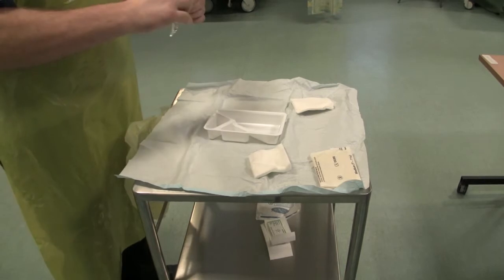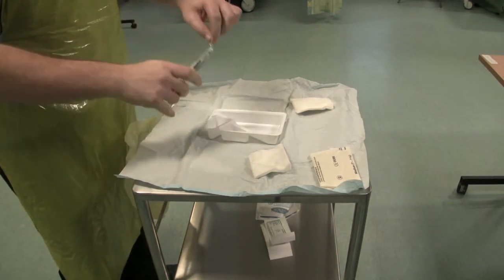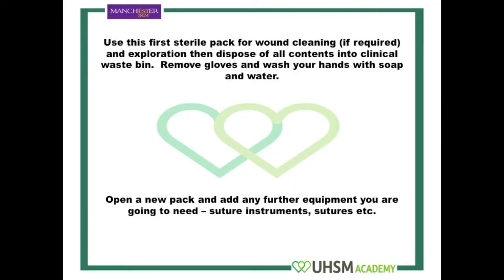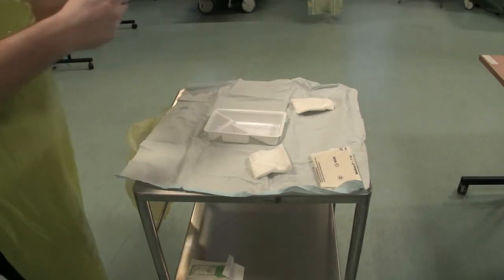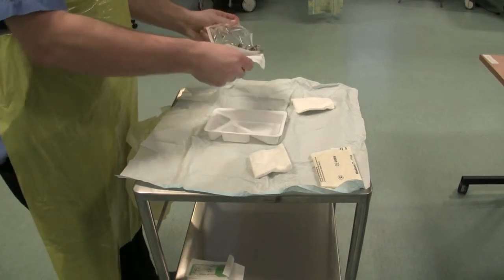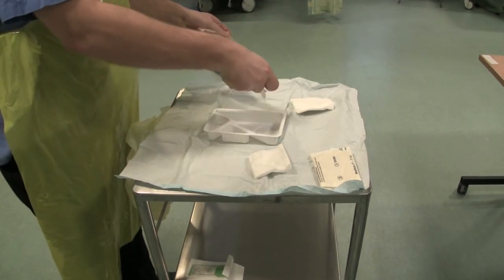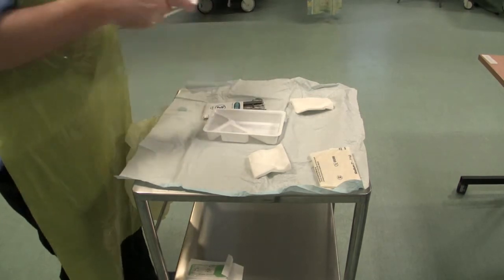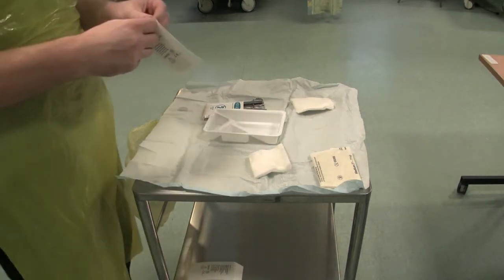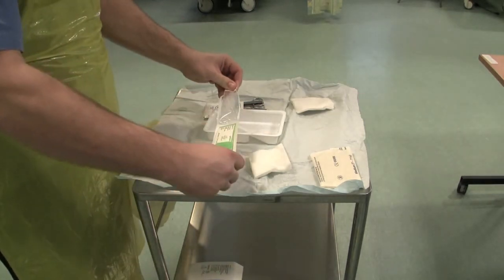Carefully open a packet of saline solution and pour it into the receiver. Open your suture instruments carefully onto your sterile field, making sure you don't touch the inside of the packaging so as not to contaminate the instruments. Also open any sutures you are likely to need.